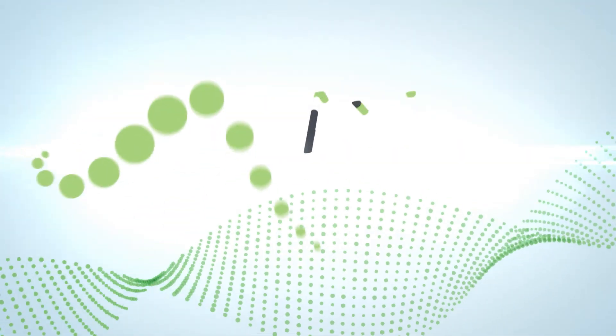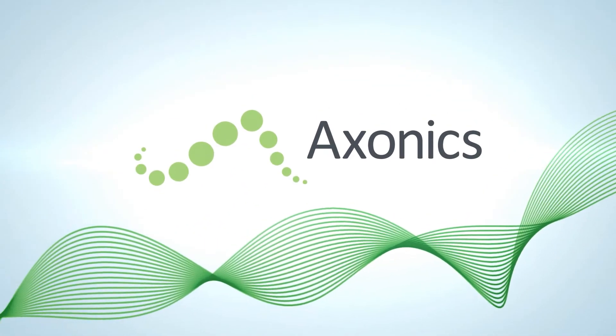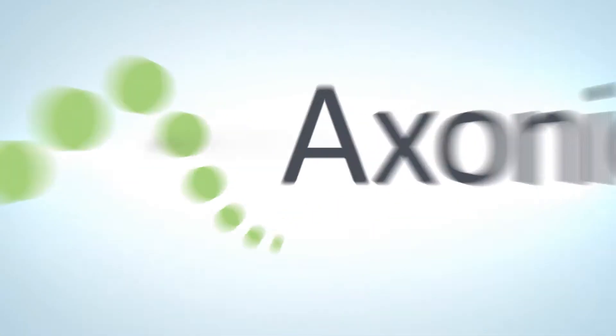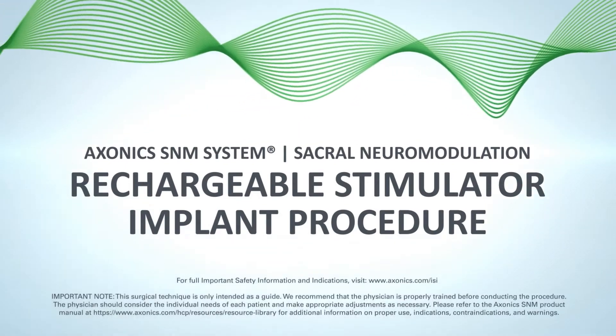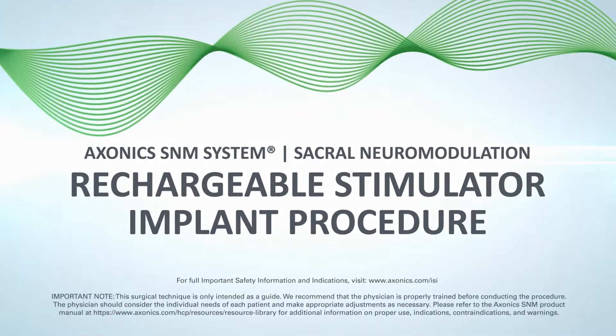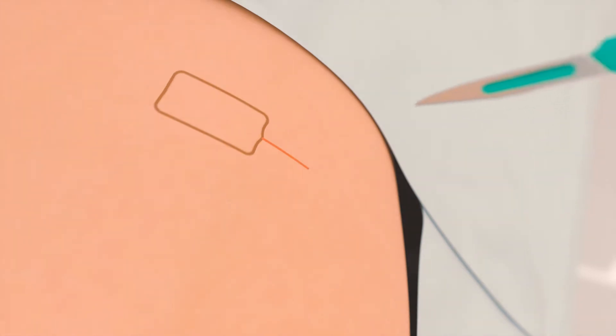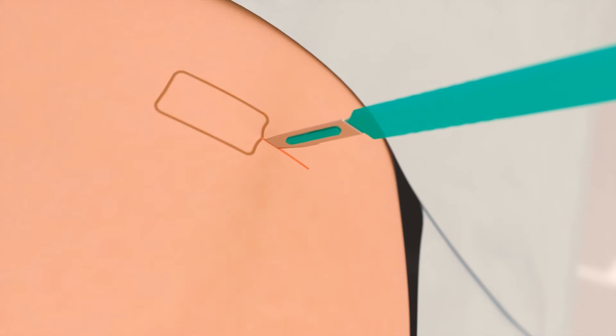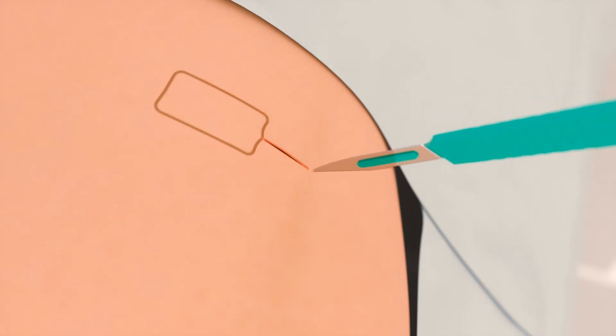This animation demonstrates the implantation of the Axonix rechargeable stimulator with the tined lead already in place. Local anesthesia is administered and a small incision, approximately two and a half centimeters, is created at the mark made previously for placement of the future stimulator.